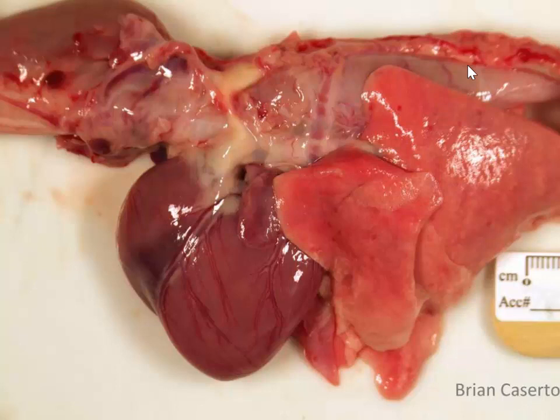Okay, I did say that there was a third morphologic diagnosis in here. This you can often see with vascular ring anomalies. And do you see this bulge here of the right ventricle? Yes, there is sort of a pressure overload because the pulmonary artery is somewhat constricted. The right ventricle has to push harder than normal, and over time will become hypertrophied and ultimately dilated in these particular conditions. So the ones I wanted were megaesophagus and vascular ring anomaly or persistent right aortic arch.